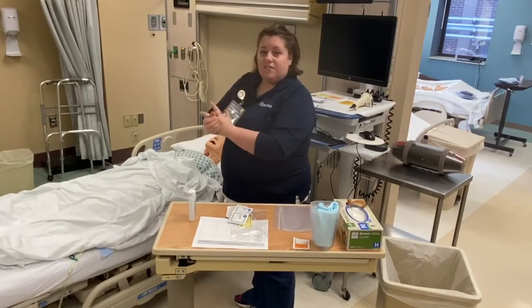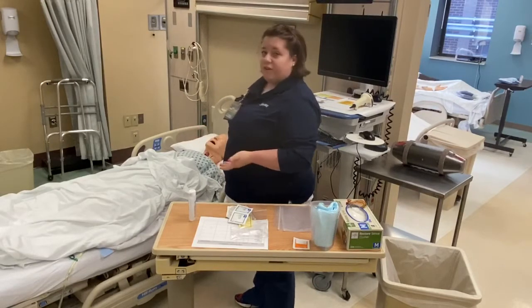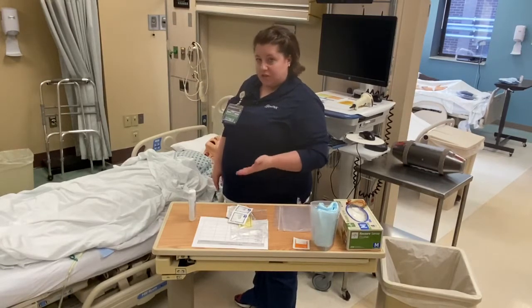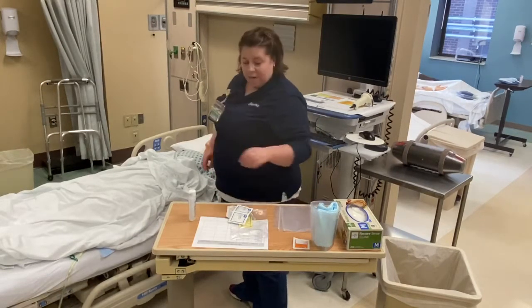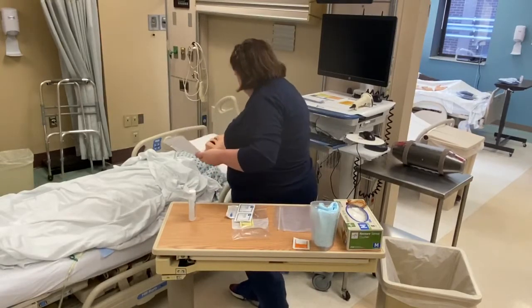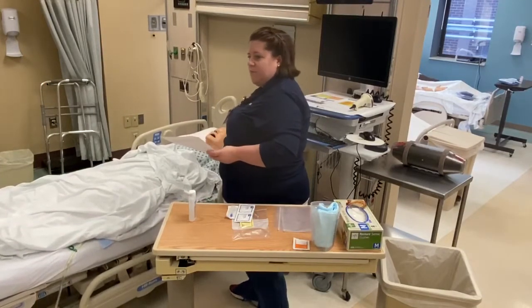So my patient has given me the go-ahead to collect a specimen from their catheter. So the first thing that I'm going to do is I'm going to ask and verify to make sure that I have the correct patient. So I'm going to get my report sheet. I'm going to come over to my patient. I'm going to raise her bed up a little bit to make it easier on myself.